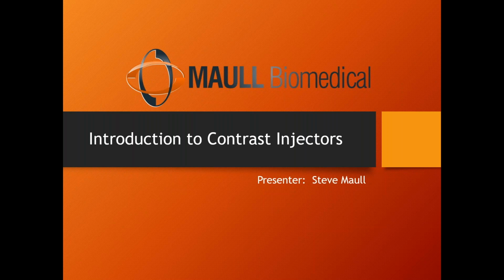Now, what I just described to you is a typical X-ray. And if you're probably aware, blood vessels don't show up on X-ray images. Most of the time, that's perfectly fine. We're not looking for blood vessels anyway, but sometimes we do need to see the blood vessels. That's why we're taking this X-ray image. But blood vessels are neither thick nor dense. An X-ray photon has no trouble passing right through a blood vessel and making the screen dark.